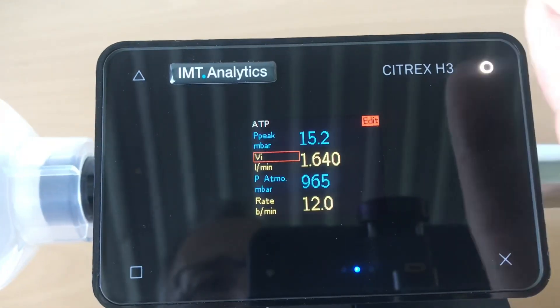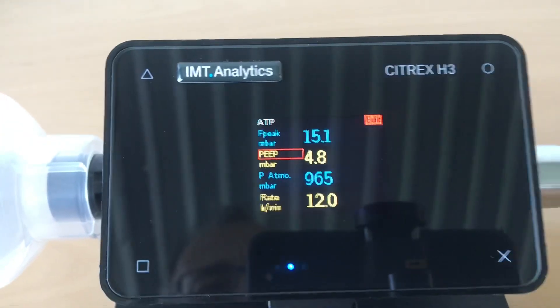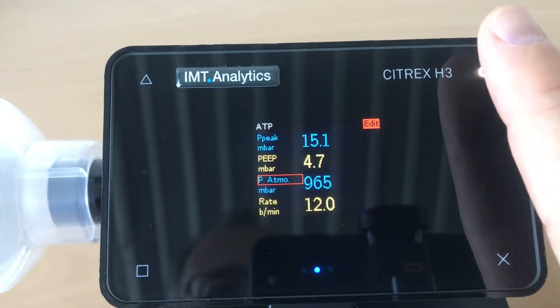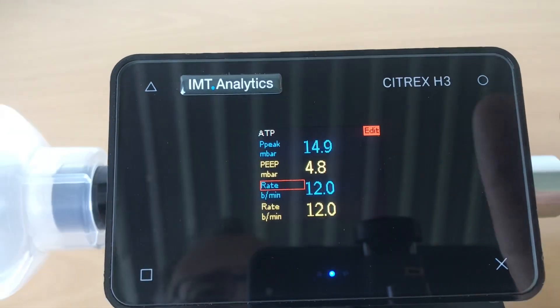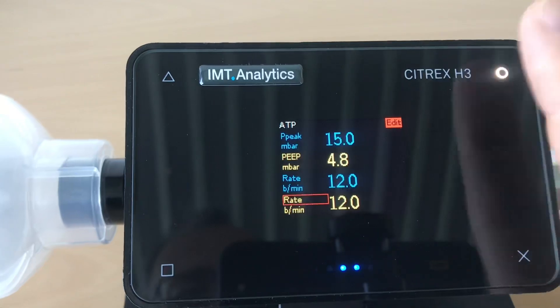You should note that IPAP on the Citrex corresponds to IPAP, and PEEP corresponds to EPAP on the ventilator. This is the only thing that's a bit tricky — you have to know this.